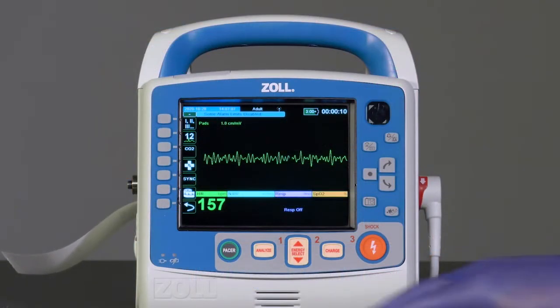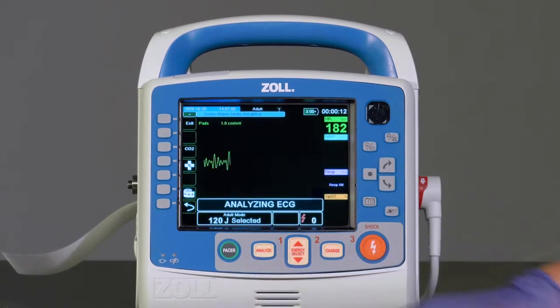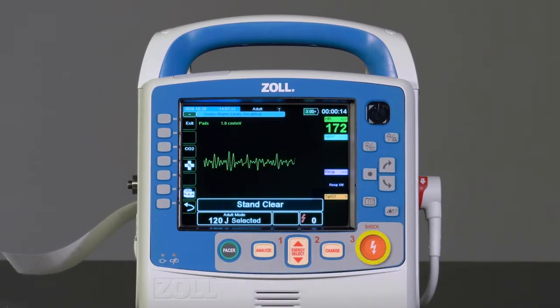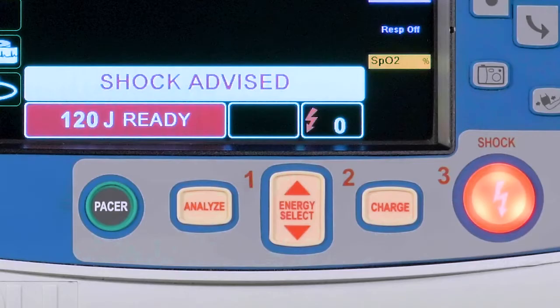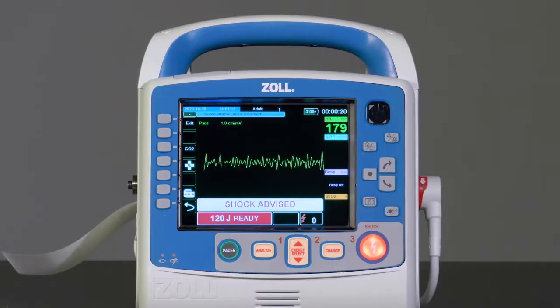If the device indicates shock advised, the red shock button will illuminate along with the message 'press shock.' Based on configuration, the device will allow 30 or 60 seconds to deliver the shock before the X-Series Advanced automatically disarms itself. Press the shock button to deliver the shock to the patient.